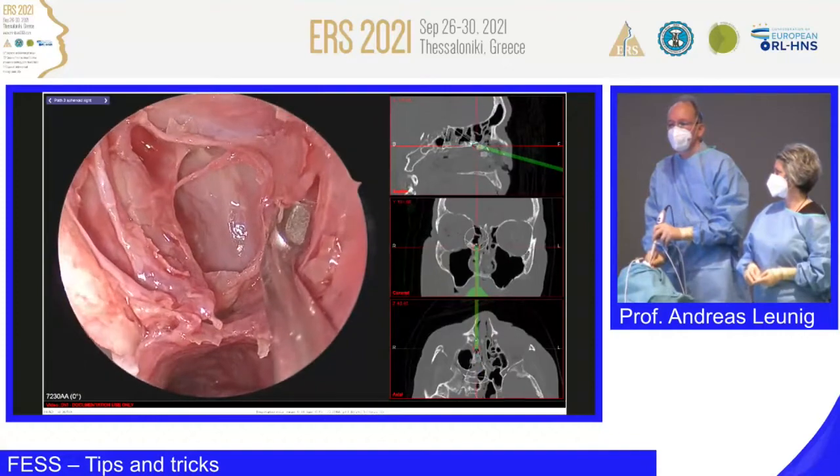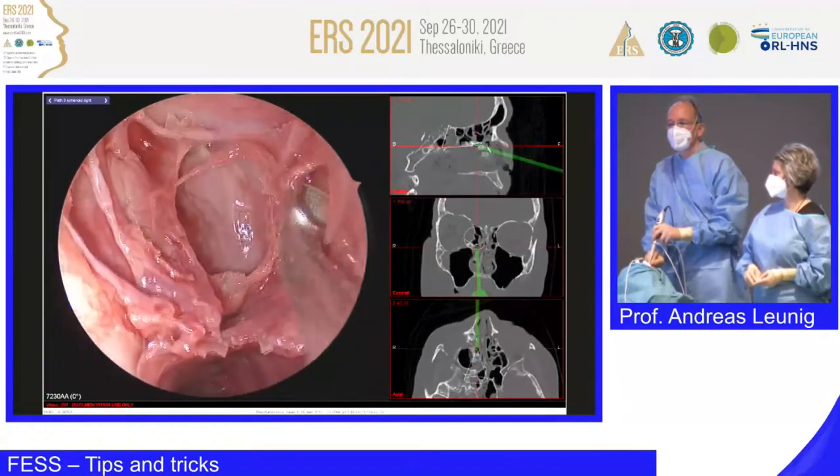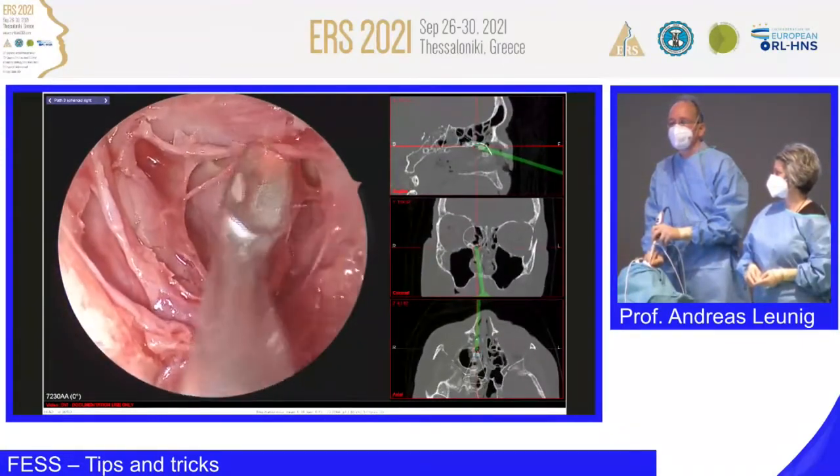So we are going in. We are fracturing a little bit more of these bony structures.